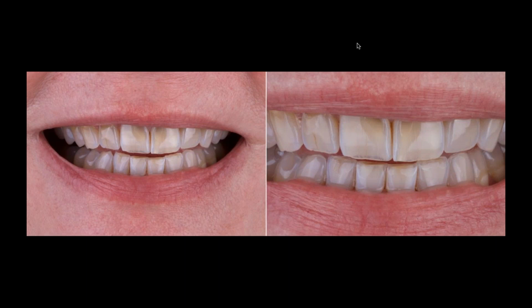So this is a case I would like to show. This was done with one of my students at the university, an international student. He came with this case, and after doing the initial analysis, we see these non-carious cervical lesions on the maxillary teeth and some wear patterns on the incisal edges and occlusal surfaces of the lower posteriors as well.